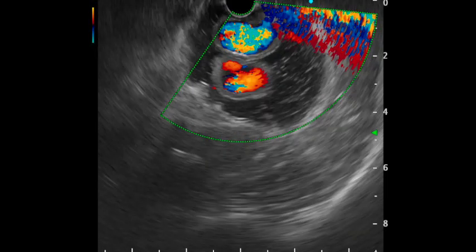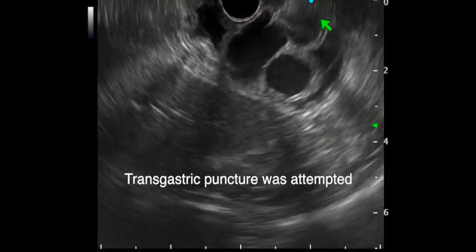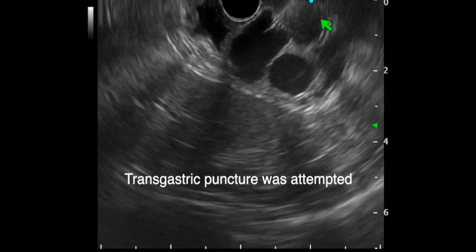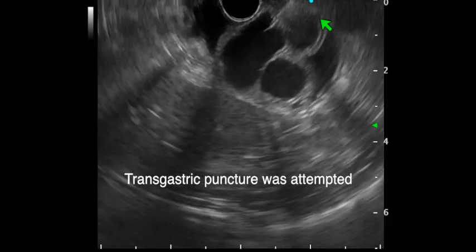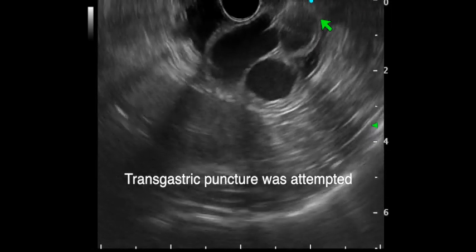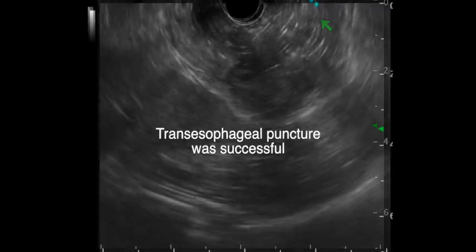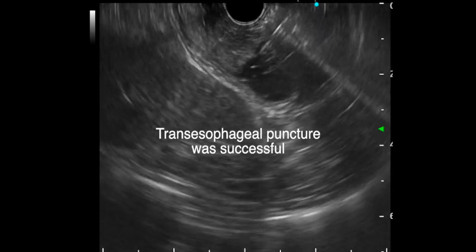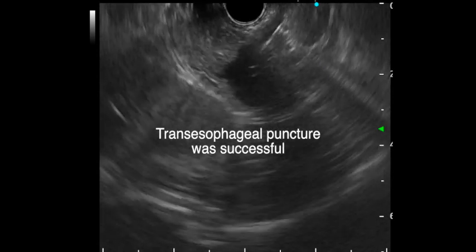So under EUS guidance, the gastric varix was punctured with a 19 gauge FNA needle. The first puncture was made transgastrically. However, on puncture, the varix was getting pushed away. So we changed the route to transesophageal, and once the needle was in the varix, the coil was loaded.